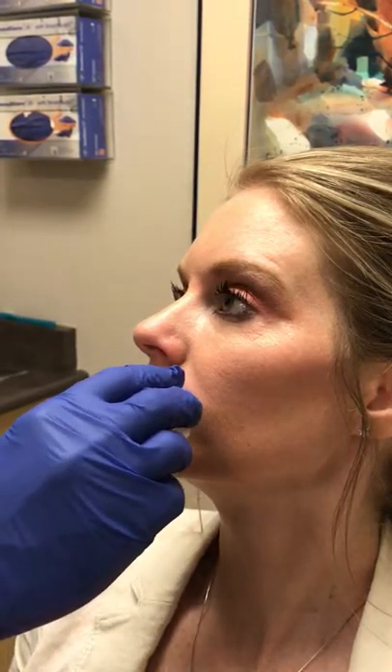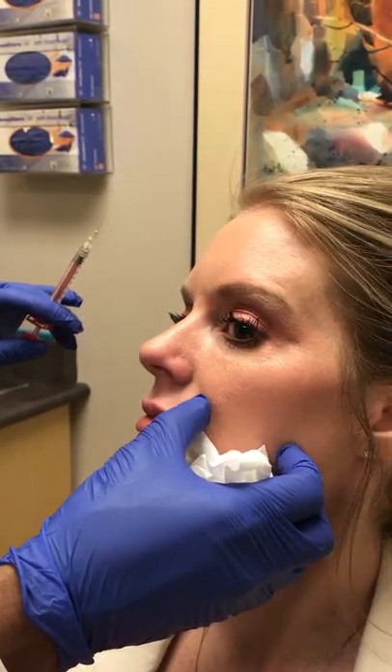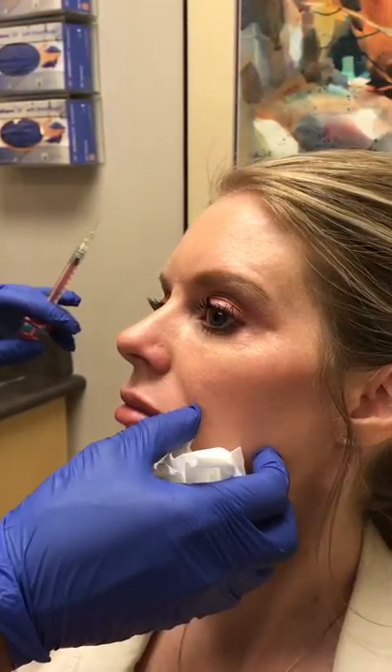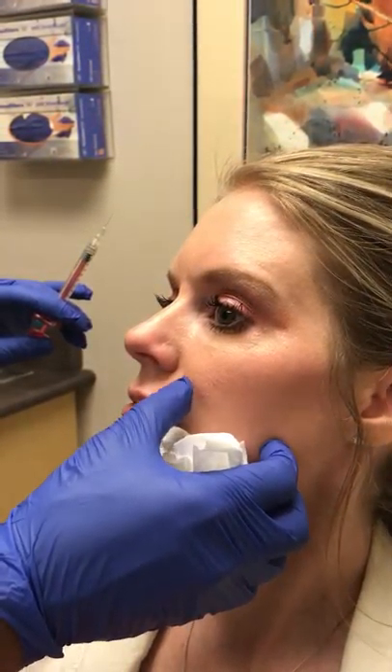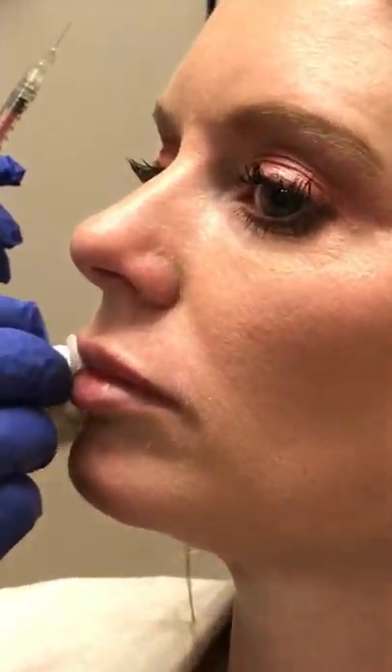That's just with a very little volume — go ahead, take a look. They just feel weird because they're numb, but they look great. Lean back for a moment, turn your head towards me. There's one little area here that I might just put a little bit there, and then we're pretty close to done.